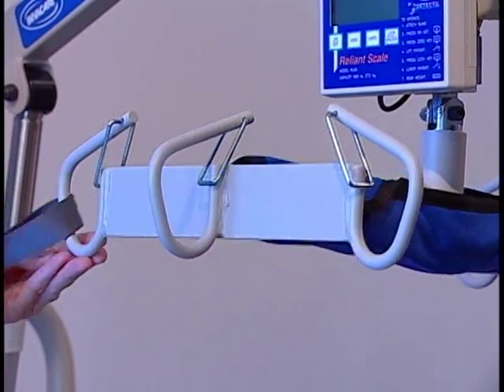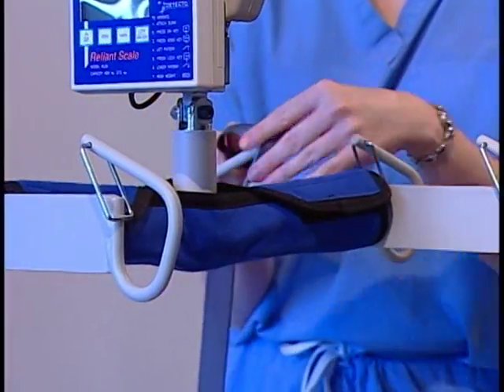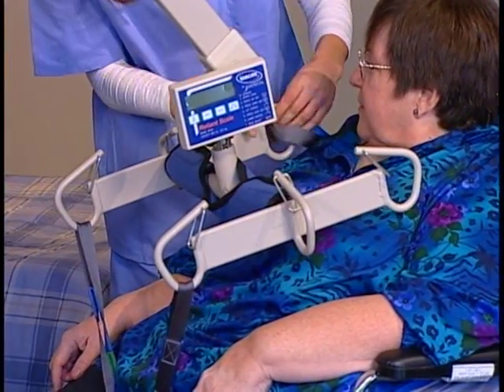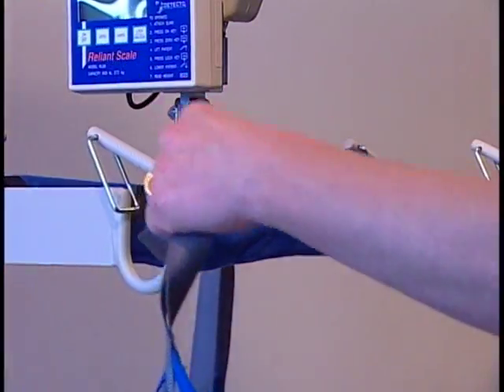First attach the straps that are near the patient's legs to the front of the swivel bar. Then attach the top straps to the back of the swivel bar, making sure you use the same color straps for both sides.